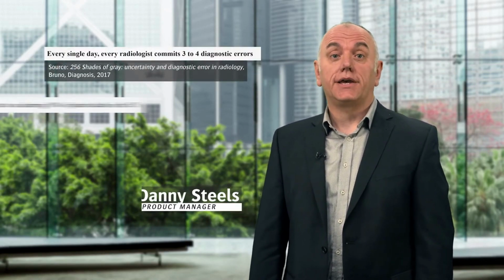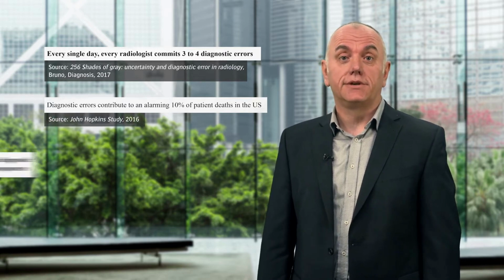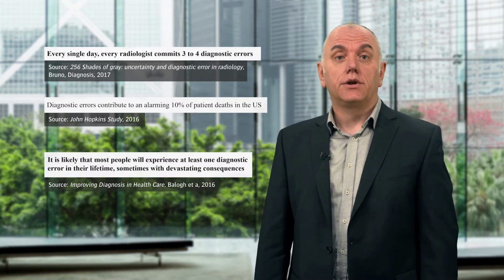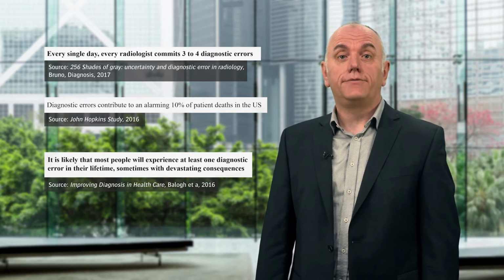Diagnostic errors in radiology are a major concern. That is why peer reviews are a fundamental part of the radiology workflow. They allow to collect and evaluate data on reading errors and act accordingly. Research has indicated that every day a radiologist commits 3 to 4 diagnostic errors. And diagnostic errors contribute to an alarming 10% of patient deaths in the US. For quality assurance, the radiology community therefore advocates peer review, where radiologists evaluate and score their peers' reports.